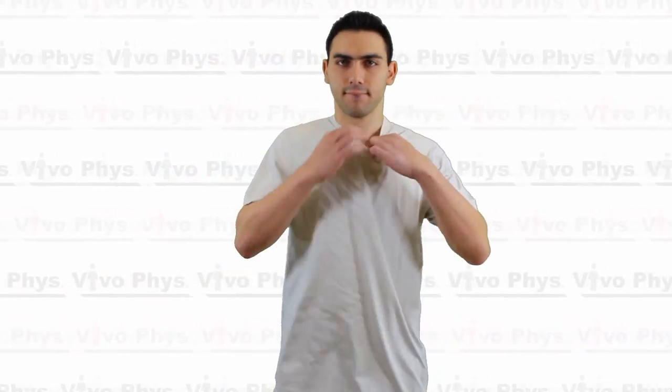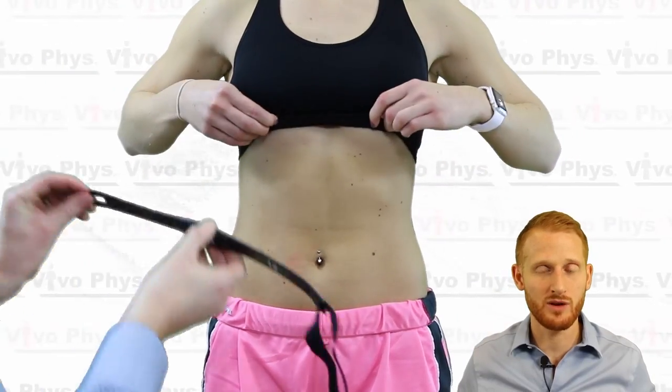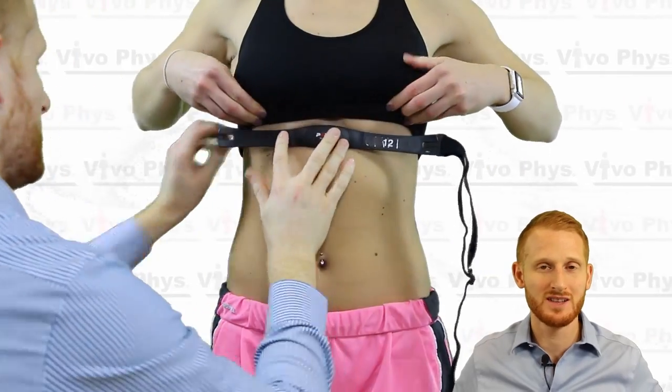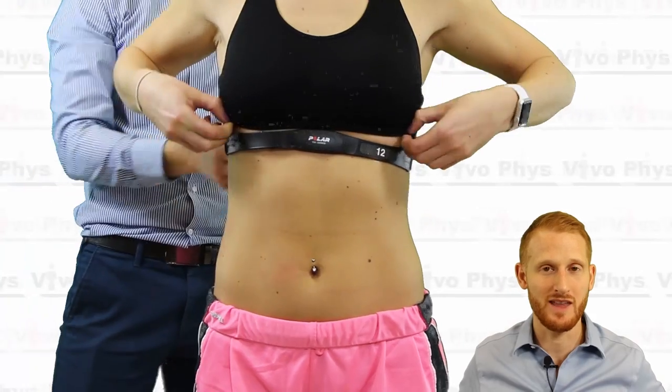Then put it onto the chest of the individual, just below the pectoral muscles or just below the breasts. This is going to require the person to typically remove their shirt or at least lift it high enough to access their lower chest. For a female wearing a sports bra, typically just fold up the bottom of the sports bra strap — that's usually where the heart rate monitor strap needs to go. For a male, look for the bottom of the chest or the bottom of the sternum and place the strap there.